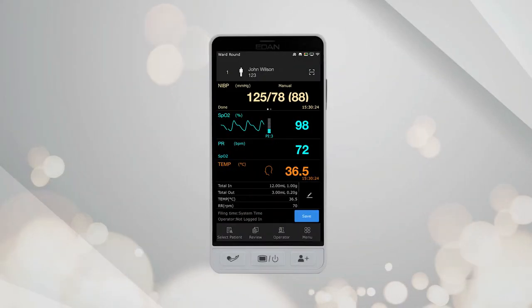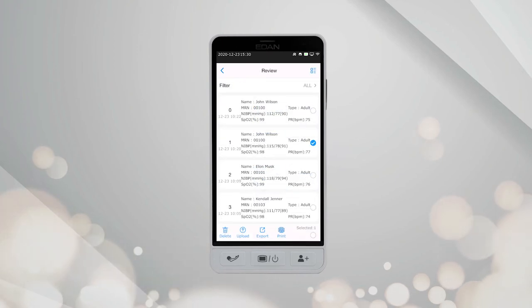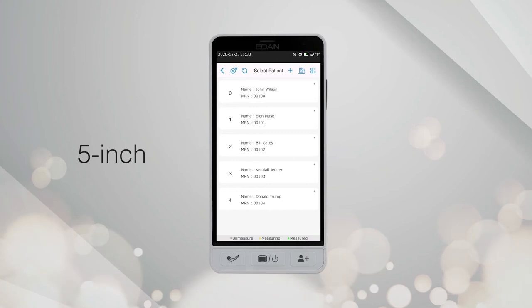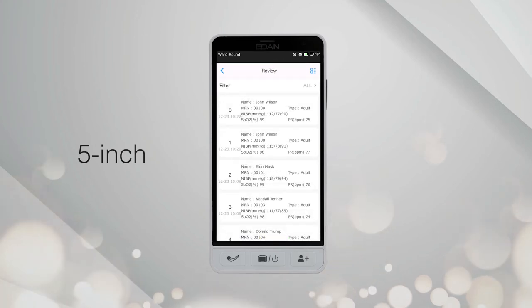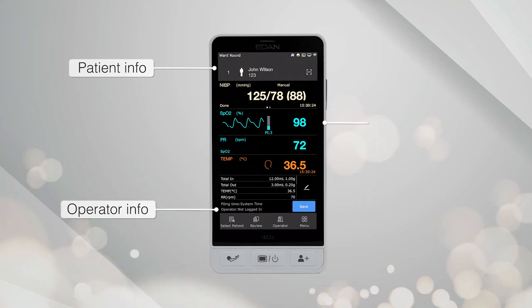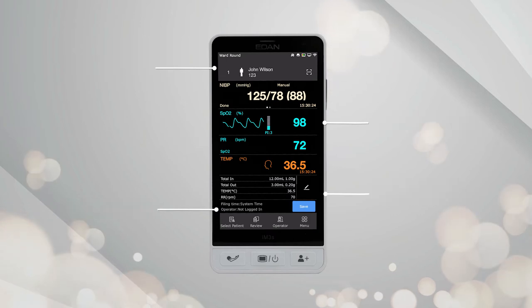As a handheld device, the IM3S is also intelligent and user-friendly, like your smartphone. Rich information can be presented with a 5-inch large display, including patient info, operator info, measurements, pleth waveform, and additional customized parameters input if needed.